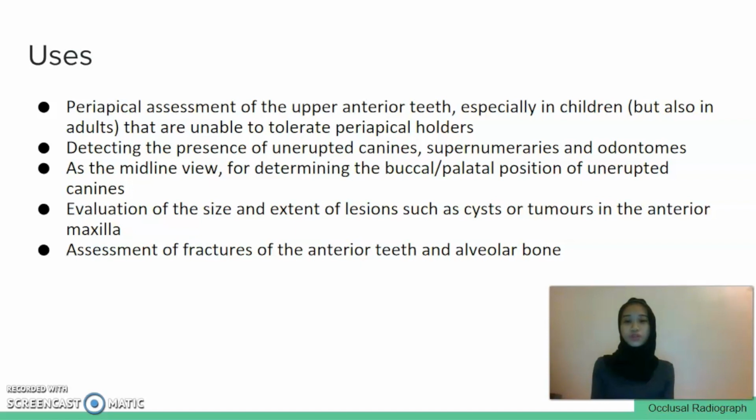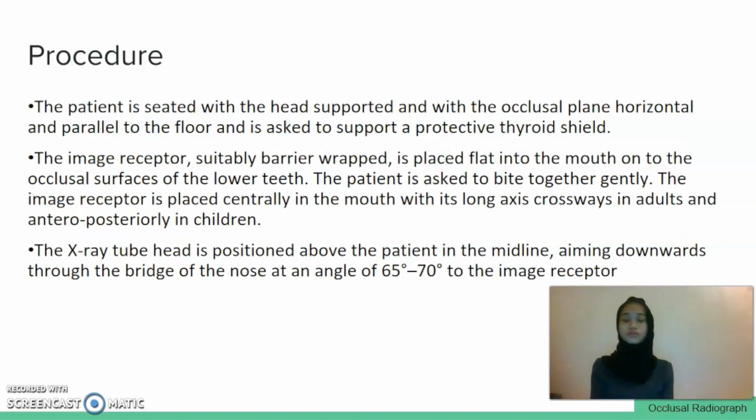In the midline view, it is used for determining the buccal or palatal position of unerupted canines. It is also used to evaluate the size and extent of lesions, such as cysts or tumors in the anterior maxilla. Lastly, it is also used to assess the fractures of anterior teeth and alveolar bones. Next, we move on to the procedure.